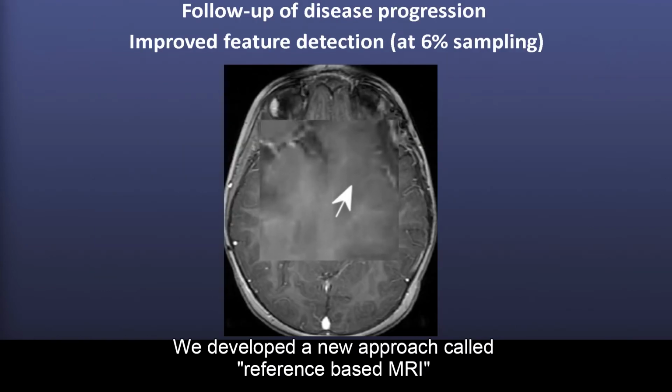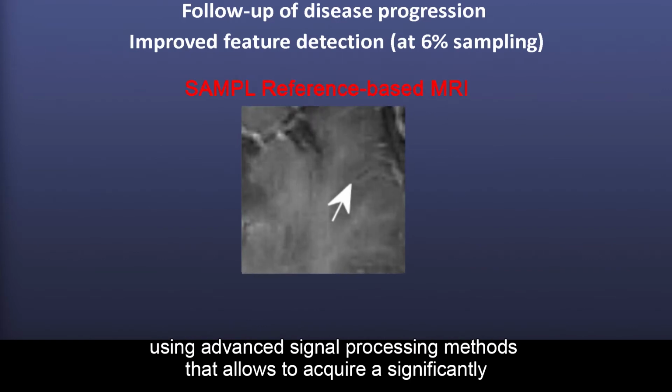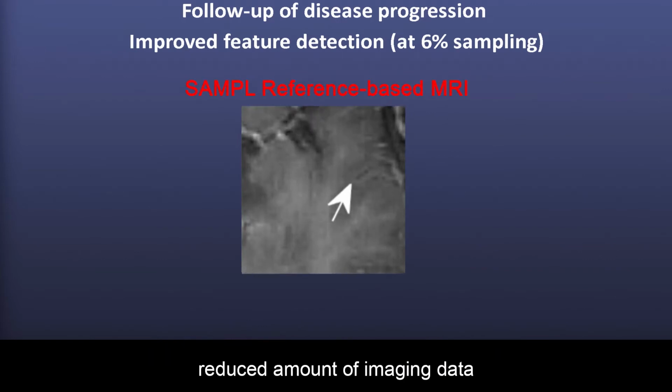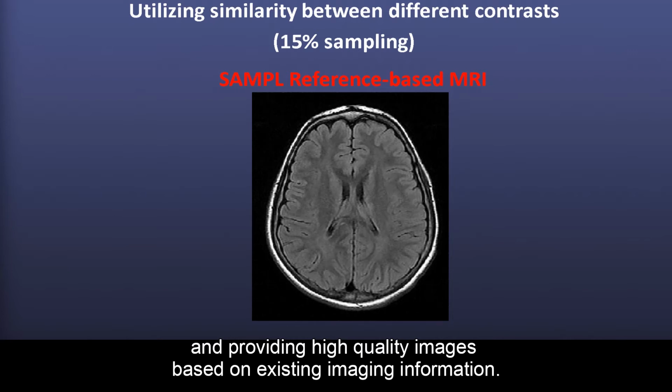We developed a new approach called reference-based MRI using advanced signal processing methods that allow to acquire a significantly reduced amount of imaging data, thereby saving time and providing high-quality images based on existing imaging information.